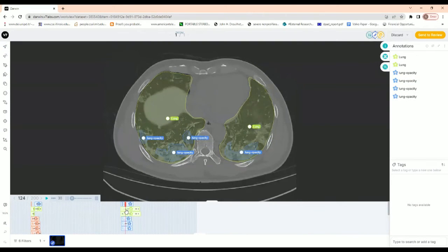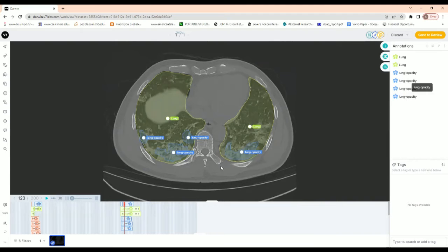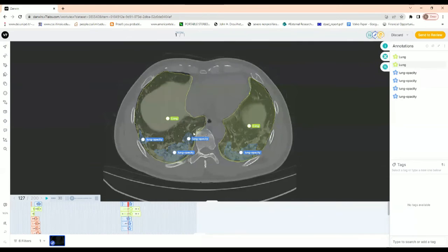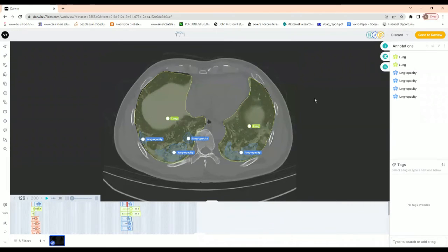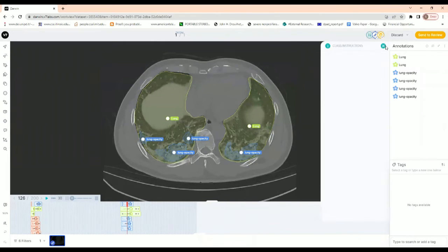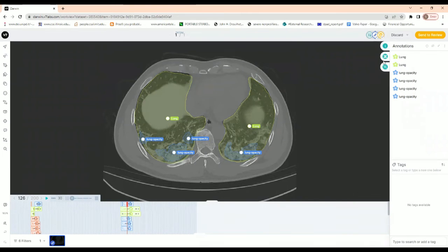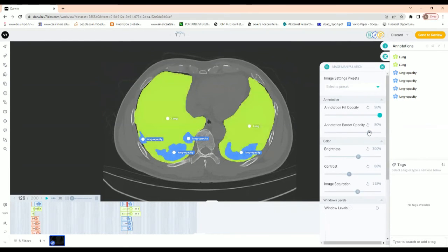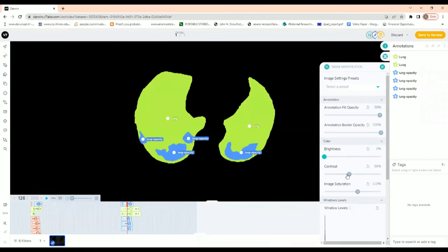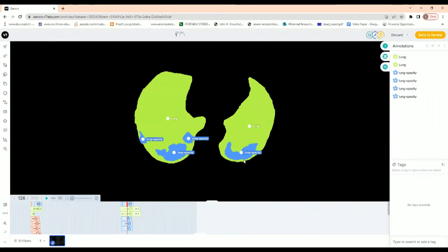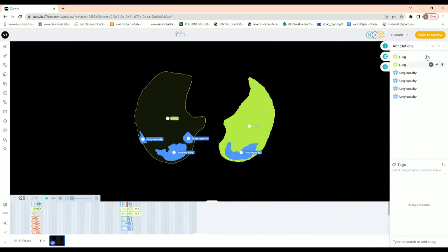Now that we have annotated, I wanted to show you the impact of the layering option in order to get your final semantic segmentation map. As you can see, you have overlapping regions — your lung and your lung opacity, which are overlapping regions of interest. To get an idea of this, we can increase the annotation fill opacity and border opacity, and reduce the brightness and contrast to see what the final semantic segmentation map would look like. Since the lung areas are the large areas, they should be the bottom layers.